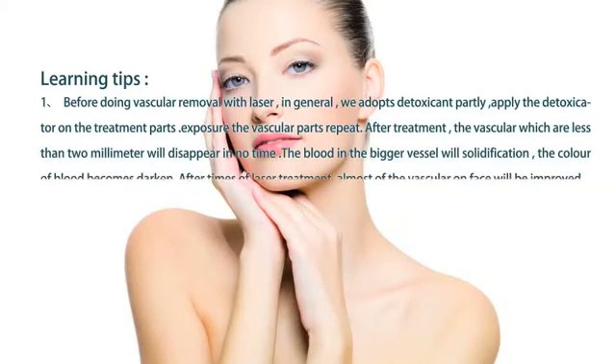Expose the vascular area and repeat the treatment. After treatment, vasculars less than 2 mm will disappear in no time. The blood in larger vessels will solidify and the color of the blood becomes darkened. After multiple laser treatment sessions, almost all of the vasculars on the face will be improved.